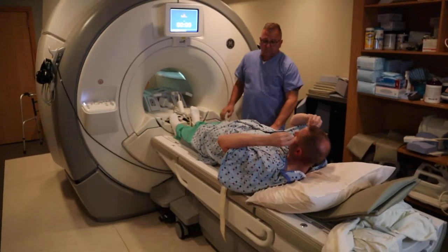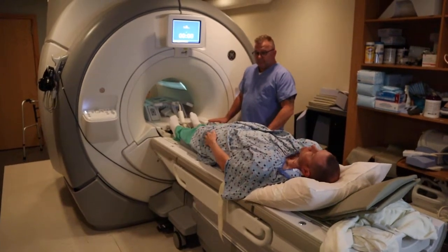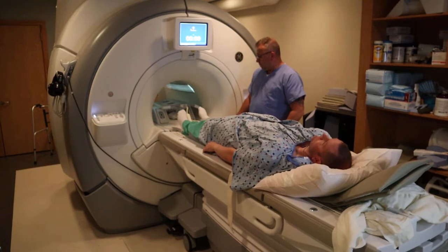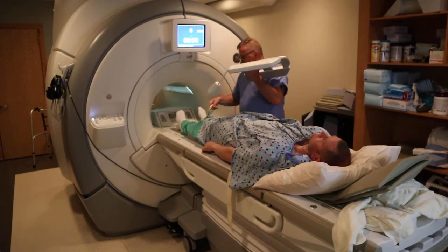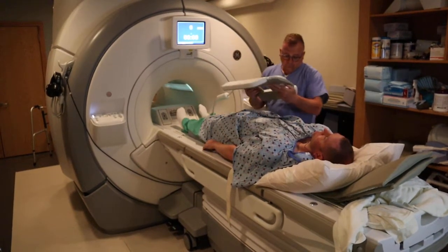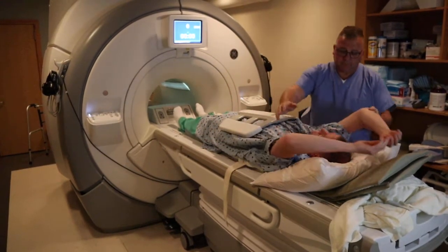The patient is going to put earplugs in his ears, and in some cases there might be a need for respiratory bellows. This will be taught in our program under abdomen. Respiratory bellows allow the machine to calculate when is the optimal point to scan an abdomen sequence.